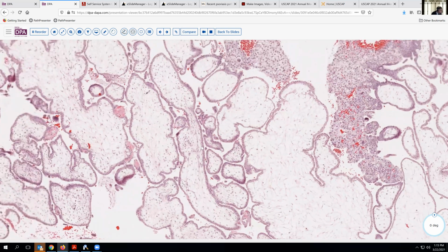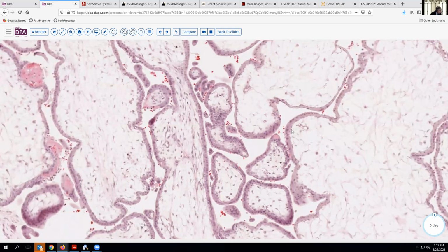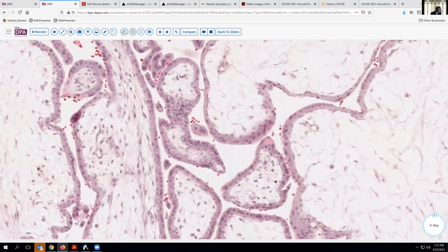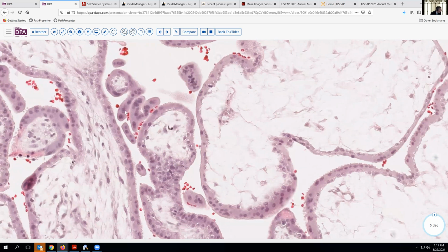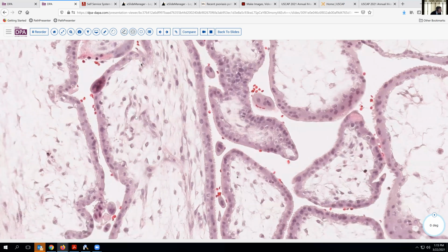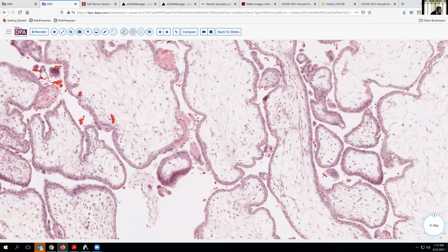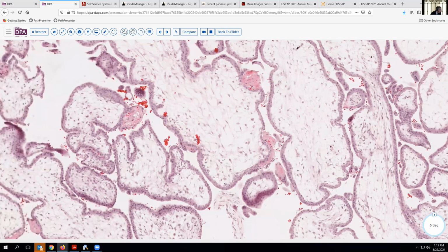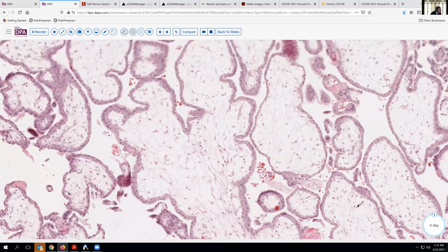Here we can see there are some small vessels that have open lumina, even maybe an occasional hematopoietic cell within some of these lumina. So possibly functional vessels here. Maybe a thorough search would allow you to identify a few more. But the point is that this is a challenging diagnosis, and one where immunohistochemistry and other analyses can come into play.